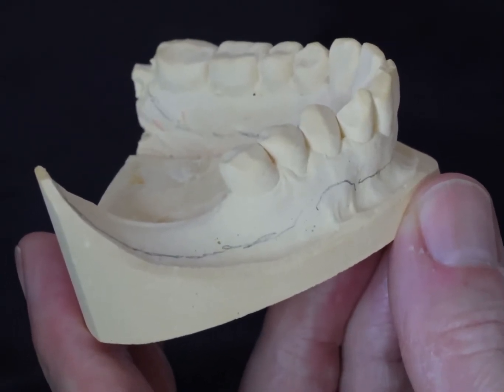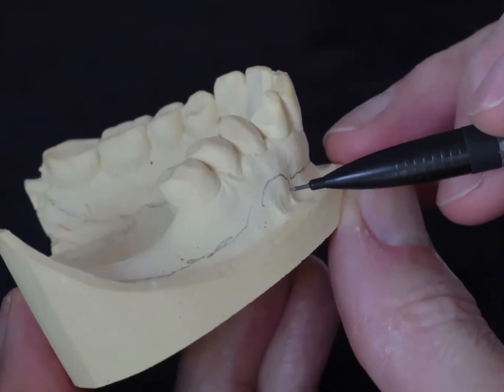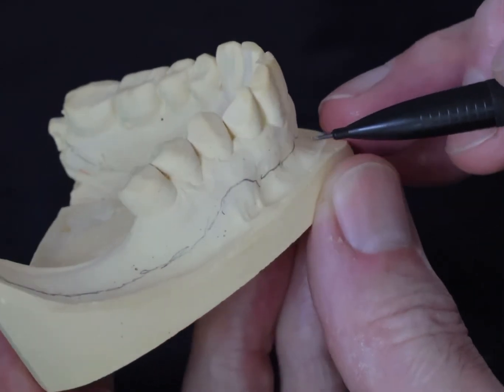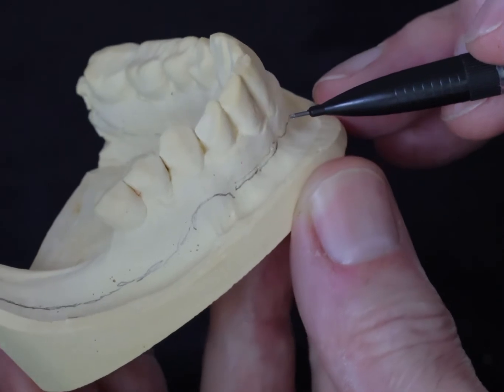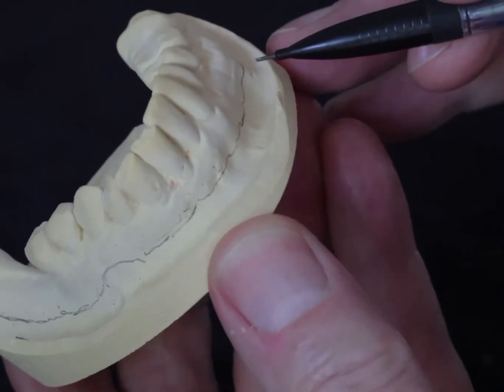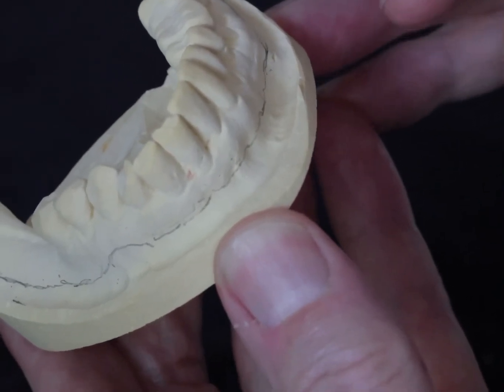Right here we have a lower cast, just outlining where you'd make the tray. You can see I've drawn over the frena, which are quite clear. You need to clearly mark the frena and draw a line where the attached/unattached mucosal junction is, which can be seen on the cast normally.